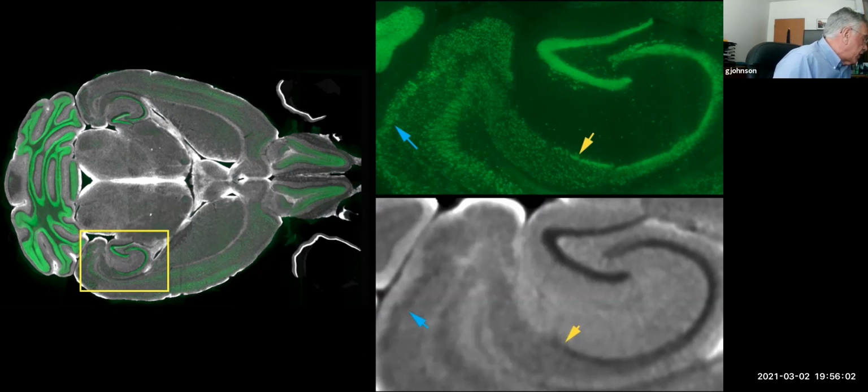The image on your screen now has been done just with that. This is immunohistochemistry staining with a fluorescent moiety for NeuN. So these are not genetically engineered with YFP. The first animals were. These are now just native strains. After the tissue is cleared, it's stained for NeuN, MBP, IBA1. So we get explicit channels for neuronal density, total cell density, and glial density.